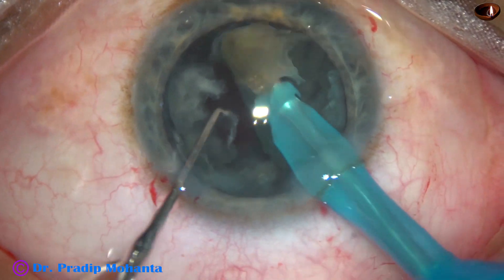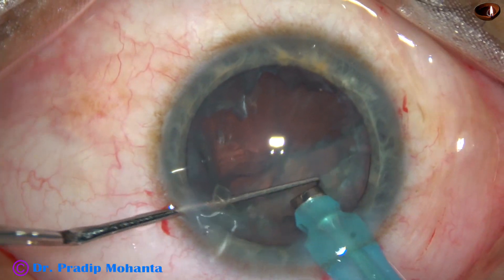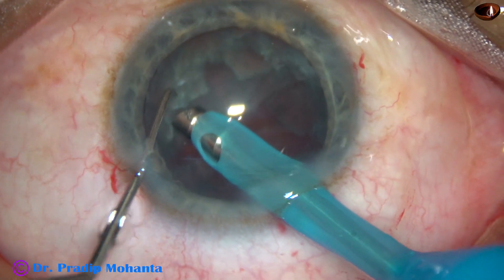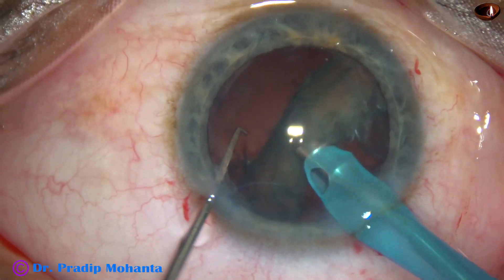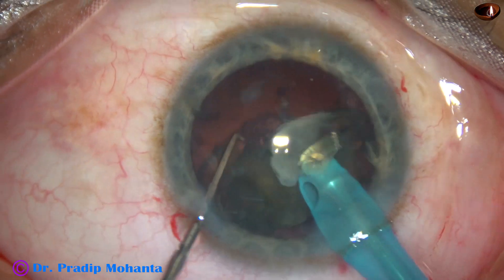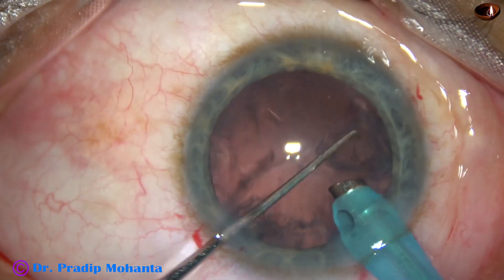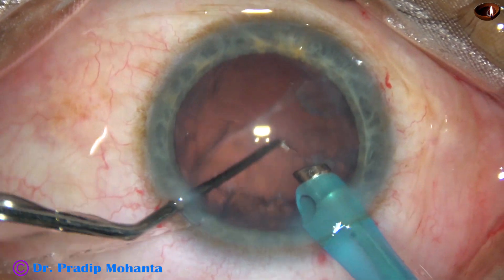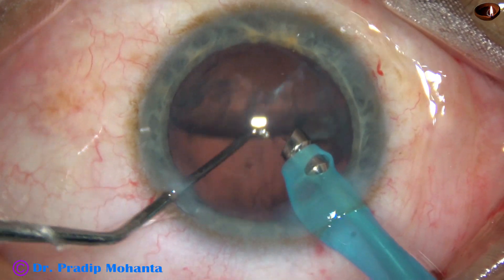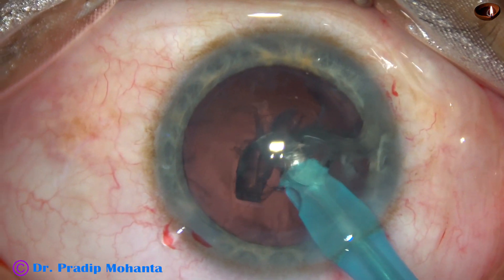The cataract is soft, and if we try to hold soft pieces, sometimes we just eat off the lens matter in front — we cannot catch hold of the nucleus. In such cases, we have to employ other techniques. In this case, the nuclear pieces were just lifted off. The last piece just tumbled and came to the phaco tip. This is a large piece of epinucleus; it is lifted off with the chopper and removed.